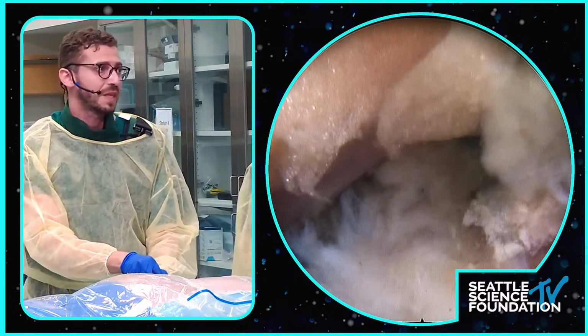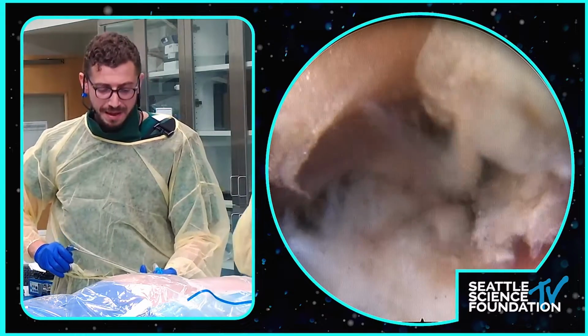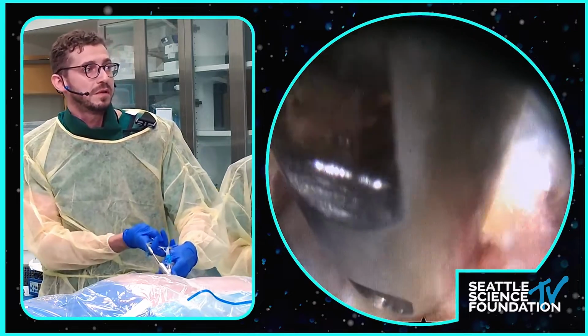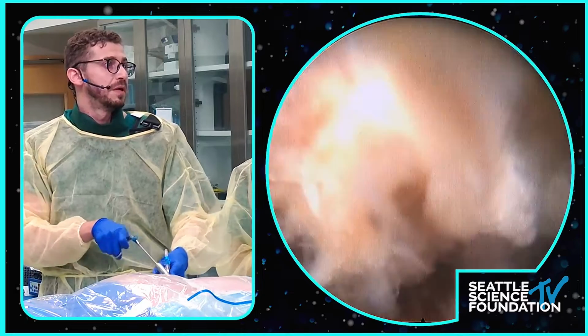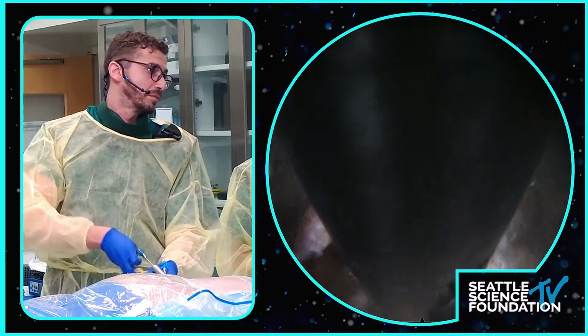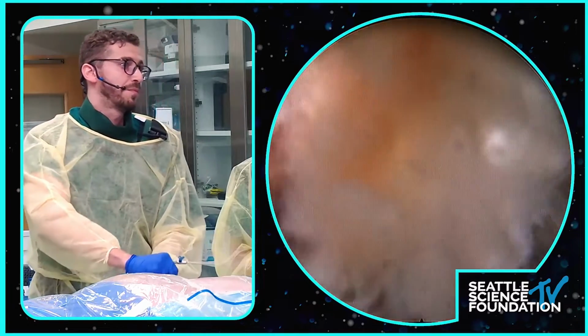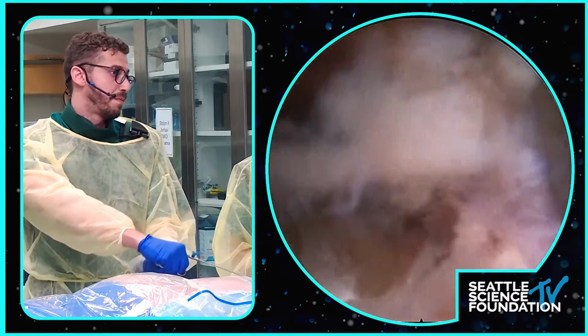I think it's an important note for the beginners that you shouldn't really be looking for the exiting nerve root when you're starting out. You can cause more problems by looking for it when you can just stay in the bottom of the foramen, unless obviously it's an extraforaminal disc, then it's a different story. But knowing your safe zones, knowing the pedicle, SAP junction, you're going to be safe there. That's where you should start out. That's where you should find home and base the rest of your dissection off of. It's kind of critical.